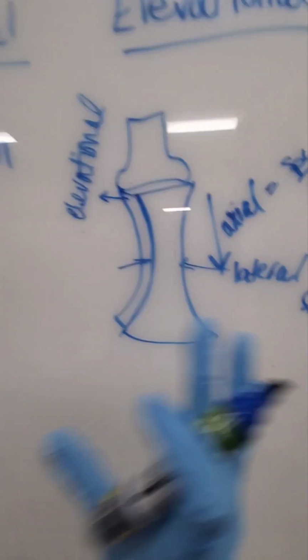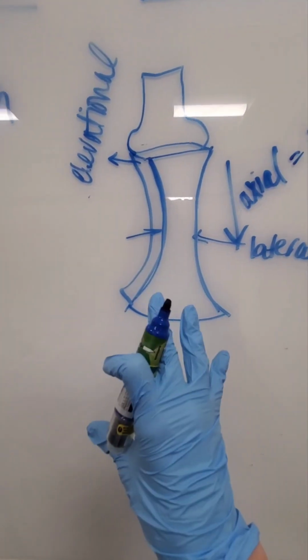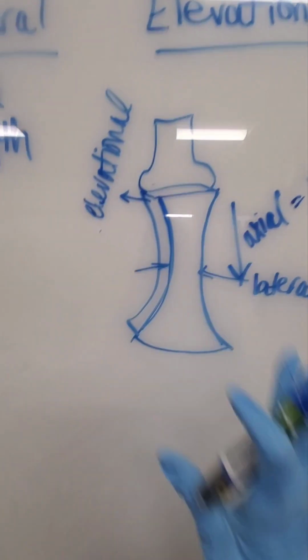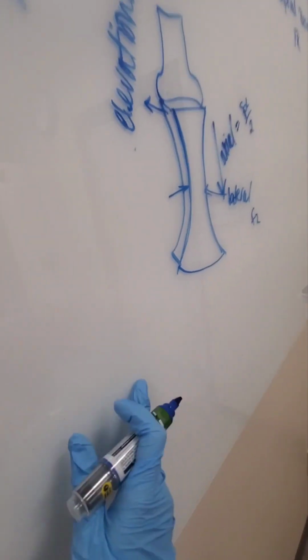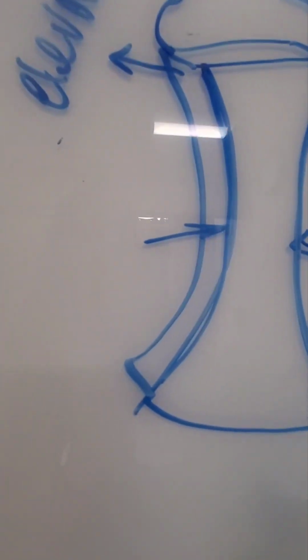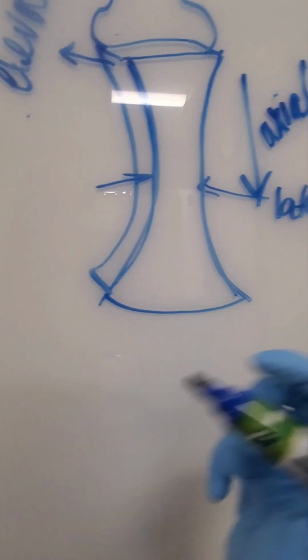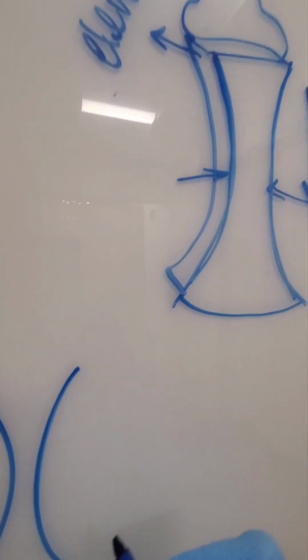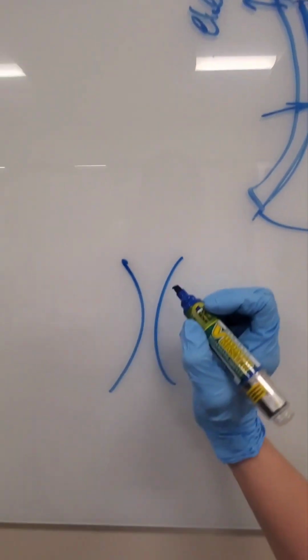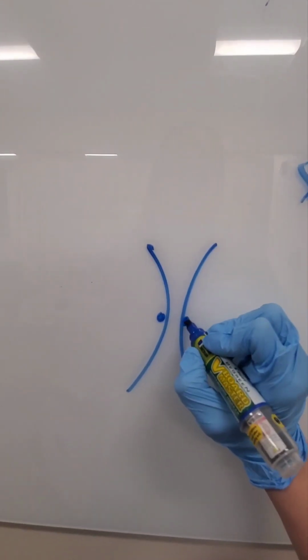Okay? In general, there are more details that go into all of this that you're going to learn about. Lots and lots and lots. So that sound beam, we can resolve things if we can fit this sound beam between those 2 things. If we are looking at lateral resolution, if my sound beam is this wide, I can resolve 2 things on either side of it.